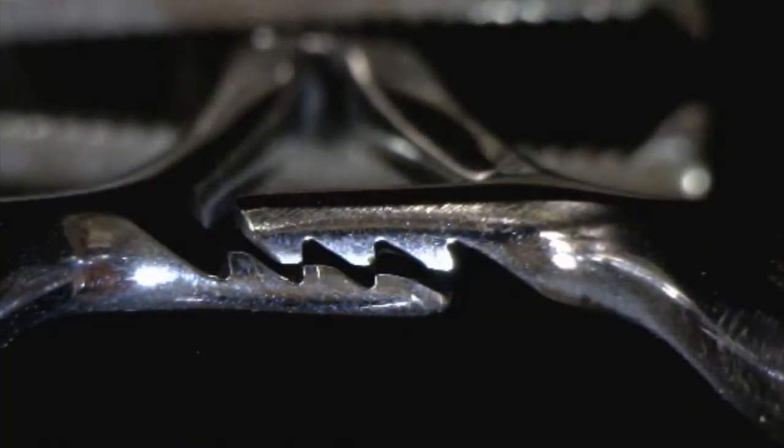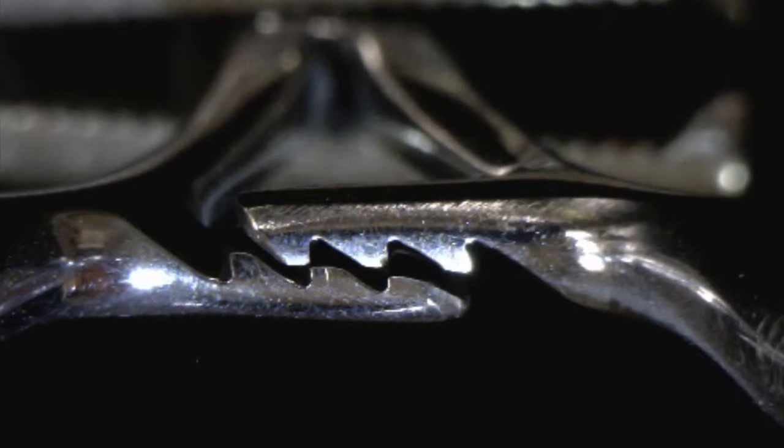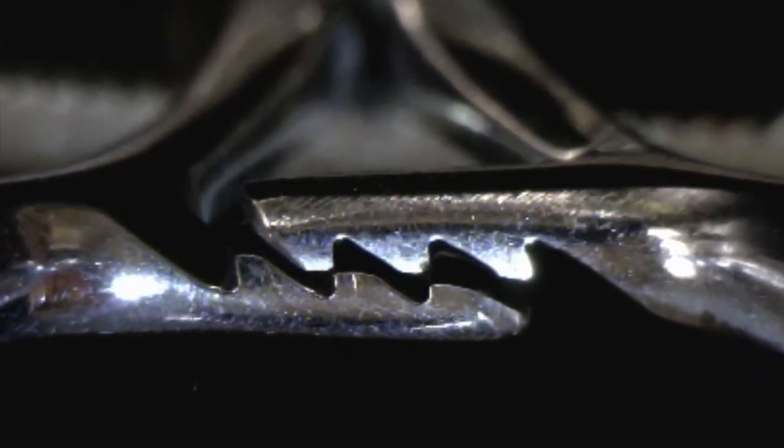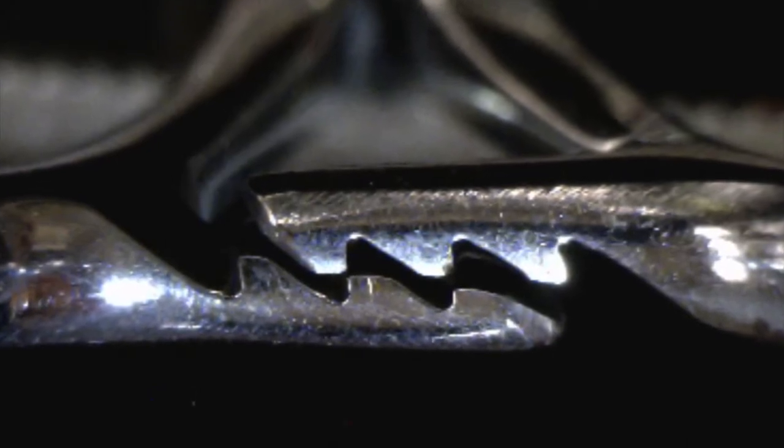Worn teeth will not mesh properly and can cause a properly adjusted instrument to not hold and close. Forceps with worn ratchets should be sent out for repair.